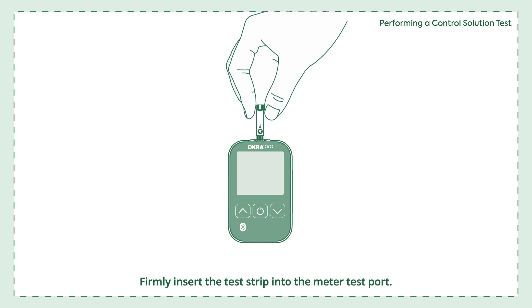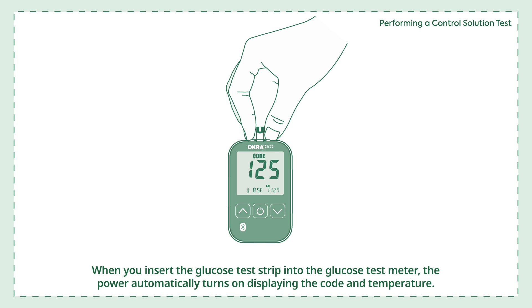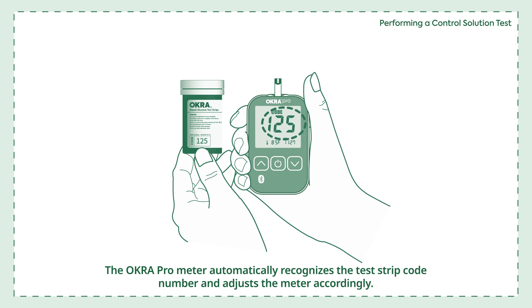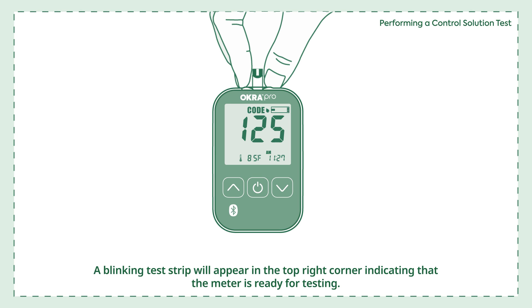It is very important that you perform the control solution test routinely to make sure you receive accurate results. Firmly insert the test strip into the meter test port — do not insert it upside down. When inserted, the power automatically turns on displaying the code and temperature. Make sure the code number matches the code on your strip vial. The OkraPro meter automatically recognizes the test strip code number and adjusts accordingly. Make sure the test strips are not expired. A blinking test strip will appear in the top right corner, indicating that the meter is ready for testing.